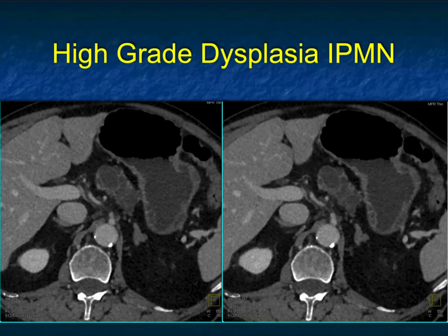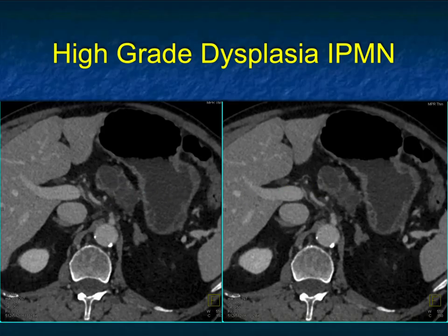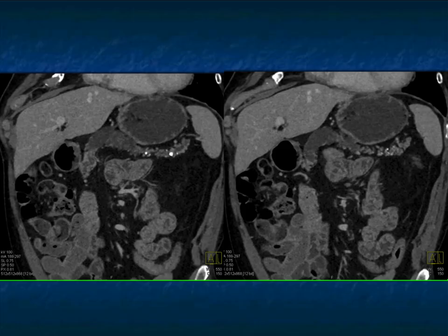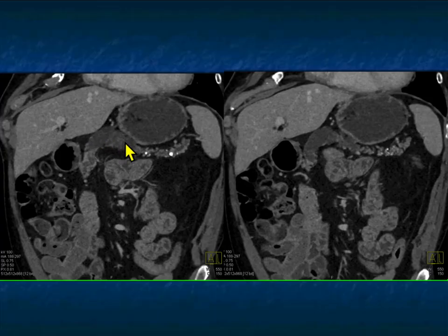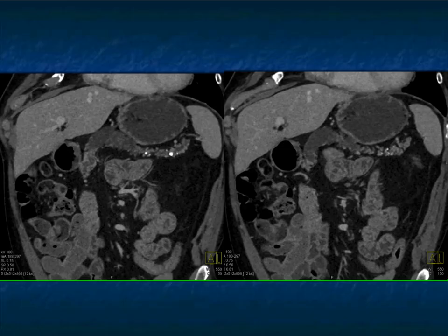On the other hand, this one is a high-grade dysplasia — you would have been worried because although it's cystic, there are multiple septations, multiple cystic lesions, and some wall thickening. On the coronal view you can see glandular calcification suggesting prior pancreatitis, the distal gland is atrophic, and the duct is dilated. You wonder: is this the main pancreatic duct, or a combination of main duct and cystic lesions? With this appearance, I'm worried about dilated main pancreatic duct and a mixed-type IPMN — possibly high-grade dysplasia or malignancy. This patient will get EUS sampling and then go to surgery.